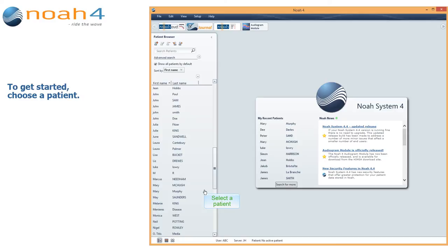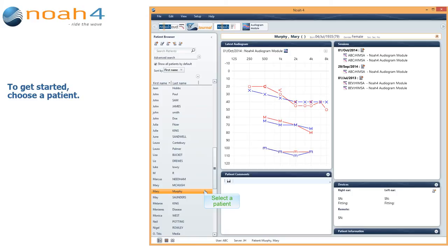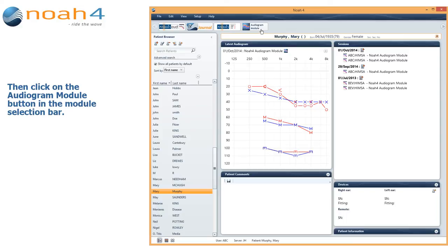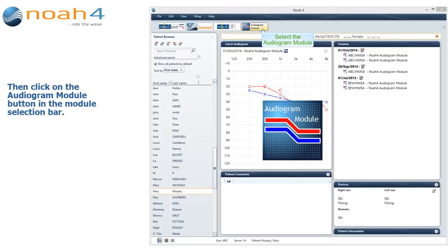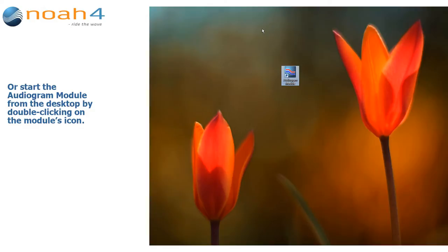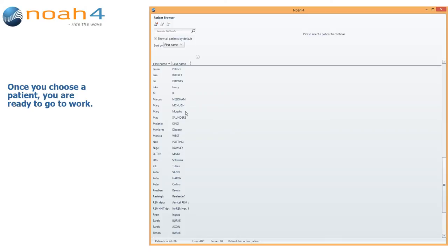To get started, choose a patient. Then click on the Audiogram Module button in the module selection bar, or start the Audiogram Module from the desktop by double clicking on the module's icon. Once you choose a patient, you are ready to go to work.